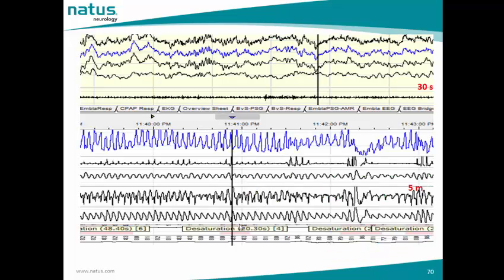This is the worksheet template in RemLogic. If we split the window horizontally, we can get two different views for two different worksheet templates on two different time bases. So here we have the neurology, and it's over 30 seconds. The other one is for the respiratory, and it's on 5 minutes.